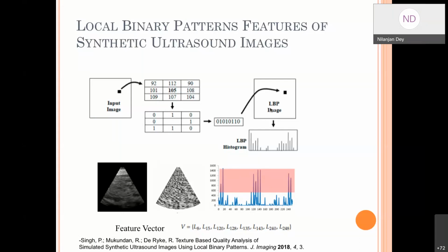And the last category is the shape feature. Shape feature means, suppose this periodontal ligament is inflamed, and you try to train your system on this inflammation. So what you will do is try to fit an ellipse. Then from that ellipse, you try to find the deformation, so the deformation needs to be trained. The ellipse tells you how much deformation there is. So in this way, shape-based study also can be done.